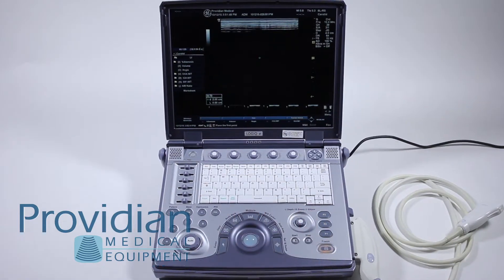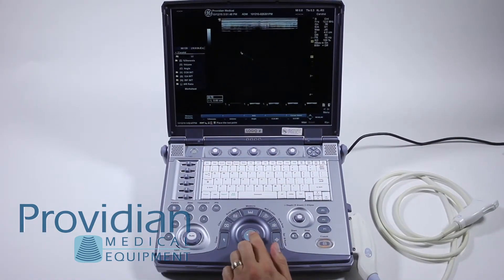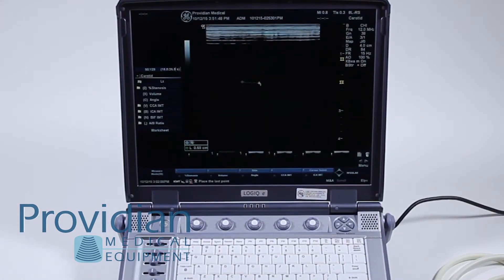First, hit the measure key and a caliper appears. Basic measurements are simply hitting set, drawing the line, and hitting set again. Note that you can hit the measure key to go back and forth and make adjustments to the previous cursor. Once you get the image you like, press set — it completes the measurement and the results box appears in the bottom left.